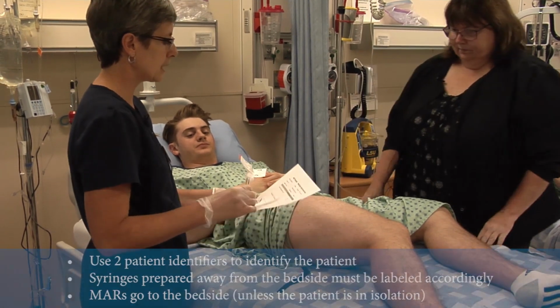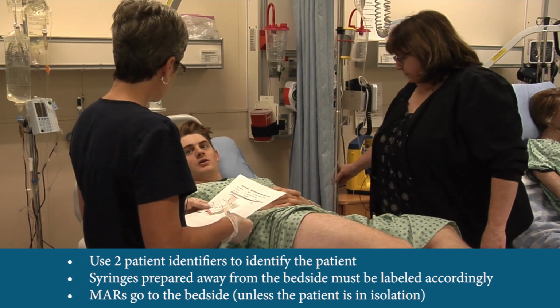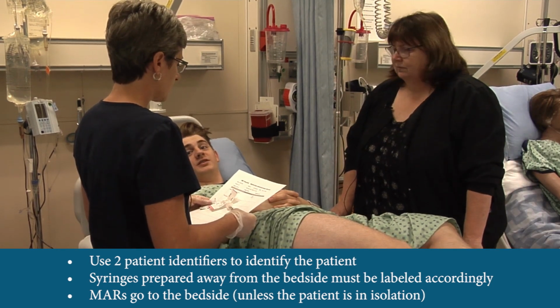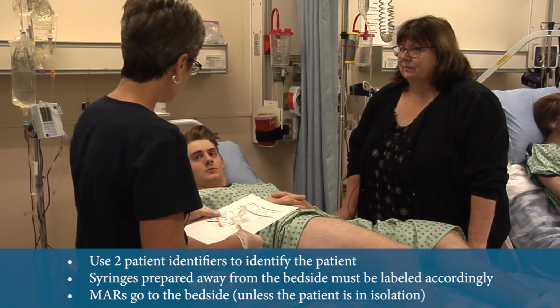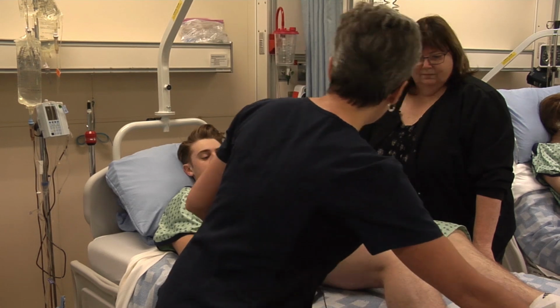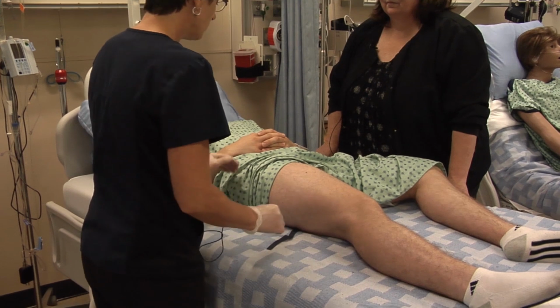So I've prepared my medication. I have my MAR at the bedside. Can you please tell me your name and your birth date? Ross Geller, March 3rd, 1999. Awesome. So I have your morphine for you. It's for pain. Okay. All right, so I'm going to put it in your leg. So if you can relax your leg muscle, I think it'll be more comfortable.